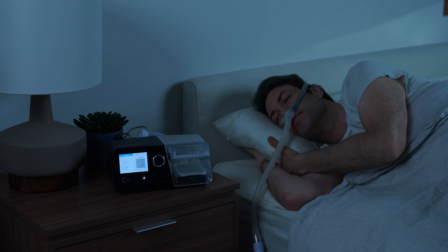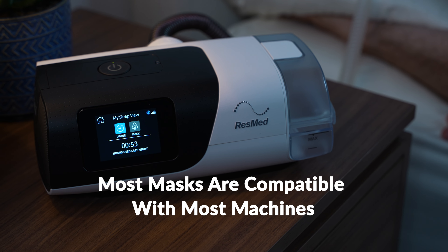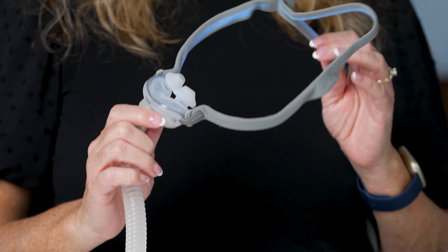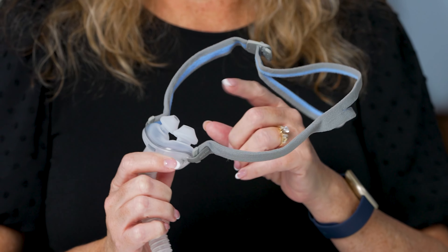Hi everyone, I'm Diane, respiratory therapist here at Sleep Doctor. I have over 20 years of experience working with sleep medicine and CPAP machines. Let's start off by talking about all the varieties of CPAP mask styles on the market. Please note that most masks are designed to work with most machines, so there's really no need to worry about compatibility issues.